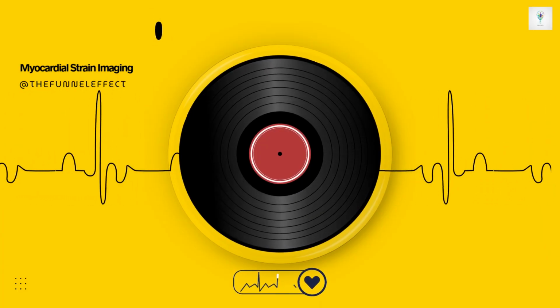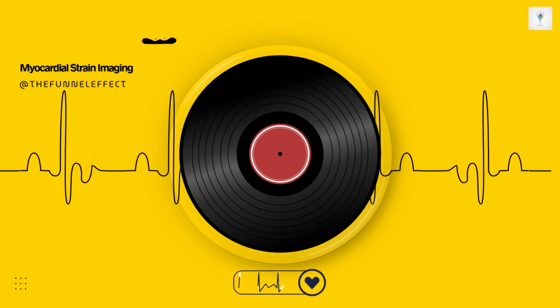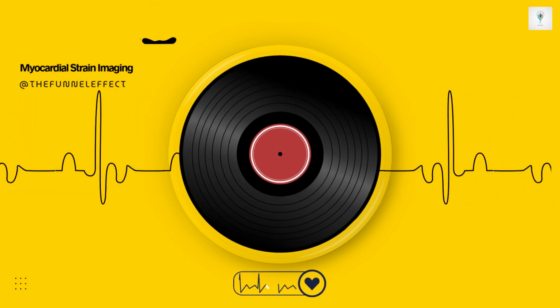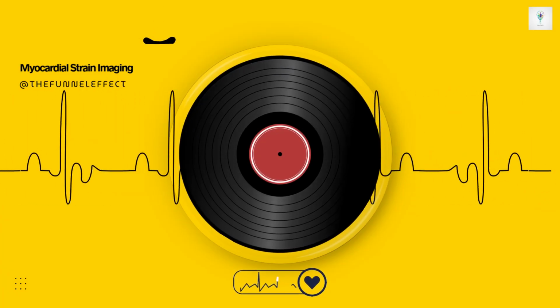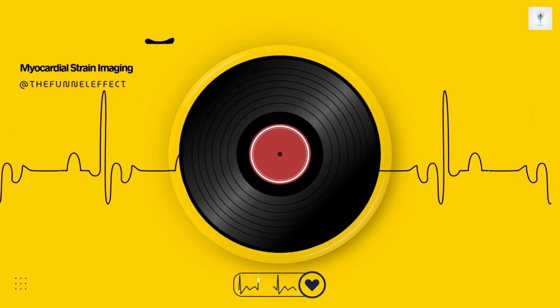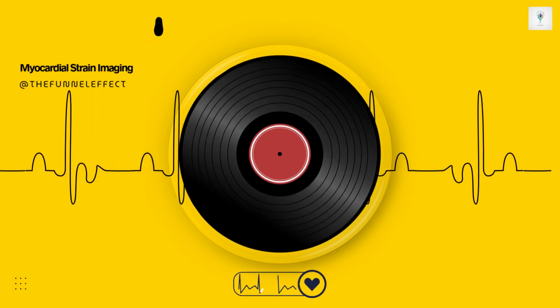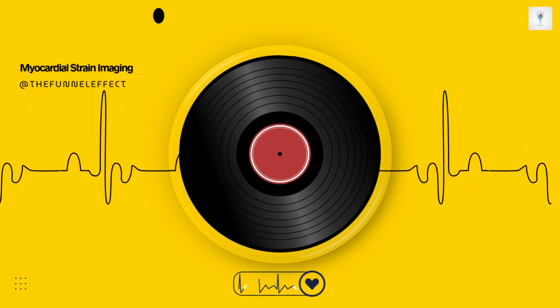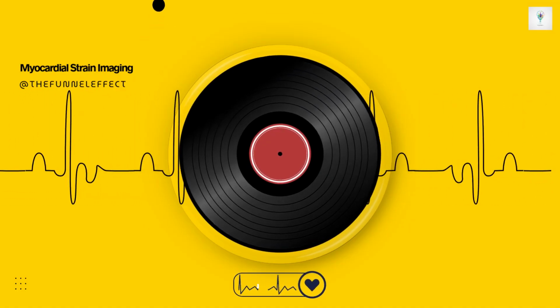It requires dedicated effort. You need an RV-focused apical 4-chamber view, optimizing the image specifically for the RV. And you have to be meticulous when drawing the ROI, making sure you only track that thin RV free wall and don't include the septum or surrounding structures. What's the key metric for RV strain? Global or just the free wall? The current recommendation is usually to focus on RV free wall longitudinal strain.